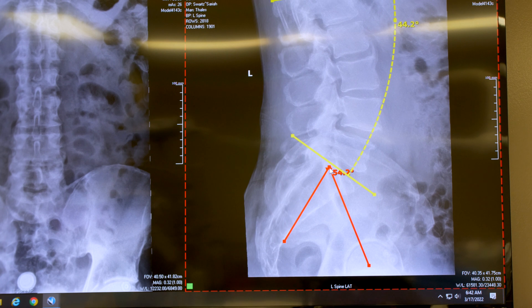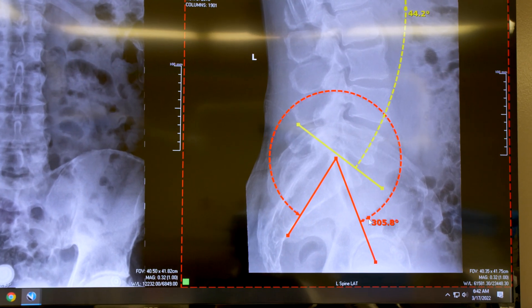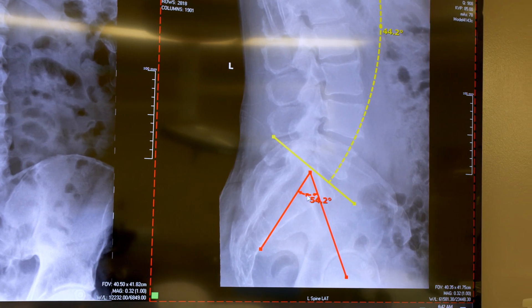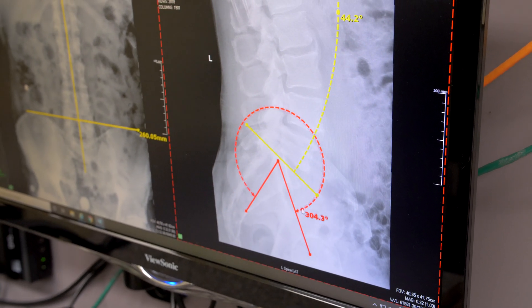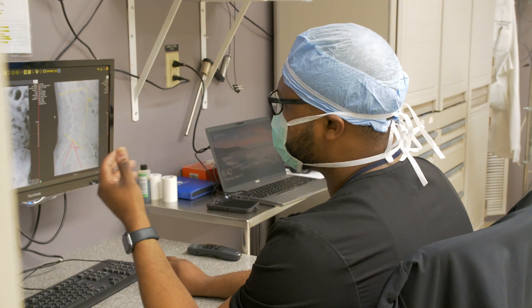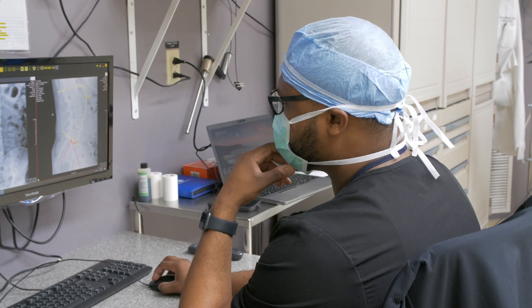Just measuring some parameters before surgery. We use a number of different parameters to tell us how much lordosis a patient needs. He's about 10 degrees shy, so I don't have to go super crazy restoring his lordosis today. He's about 10 degrees off, which is considered normal when we're looking at various parameters of the spine.